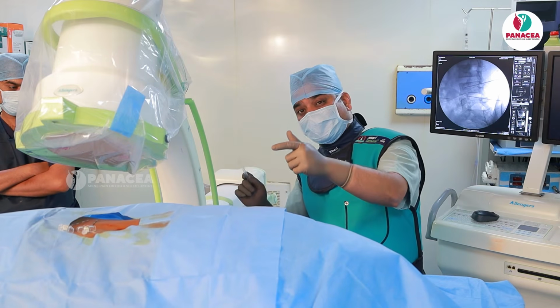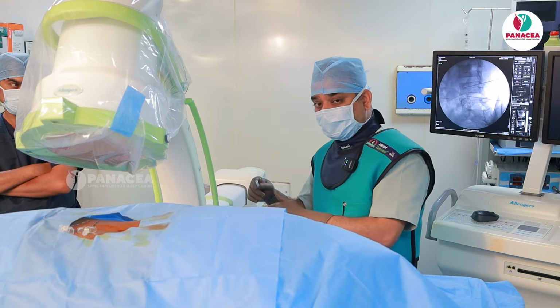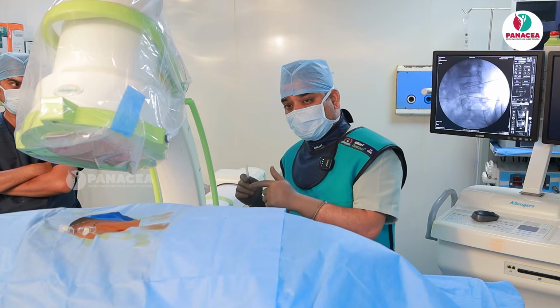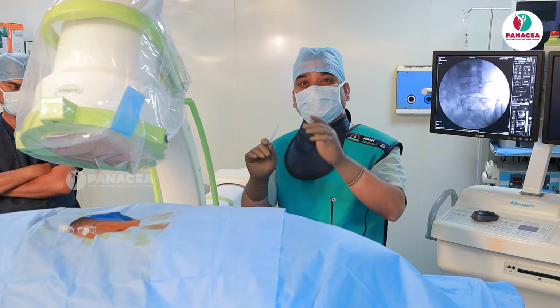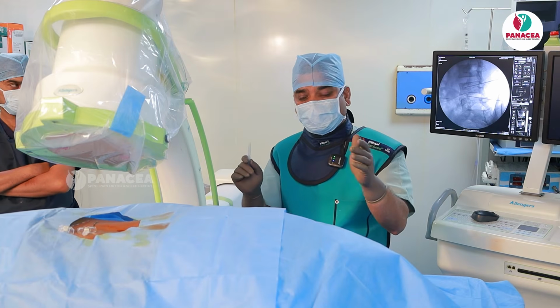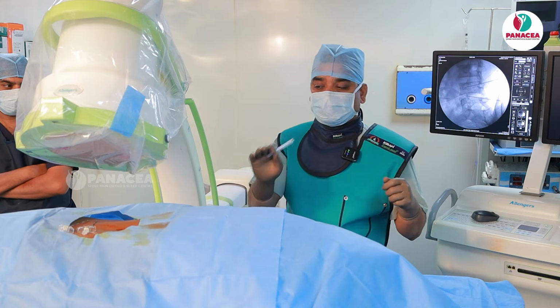So in case for this patient, since we are doing the left side, I place the C-arm on the left side. Just imagine if I had placed the C-arm on the right side and I wanted 35 degrees, it is not possible. As you know, there is a restriction. You cannot make it 30 to 35 degrees that side. So that is a problem.